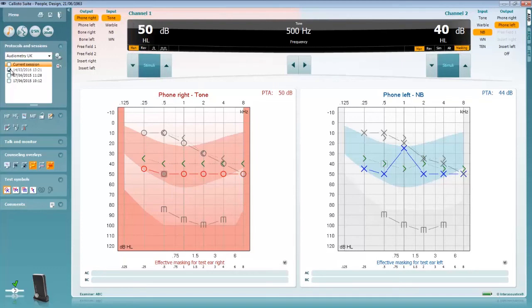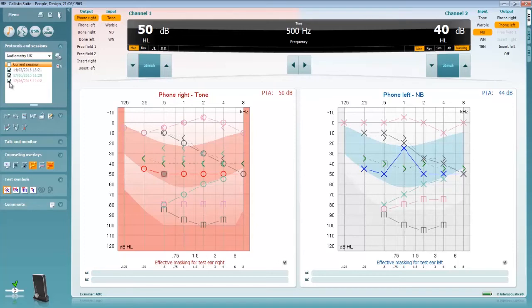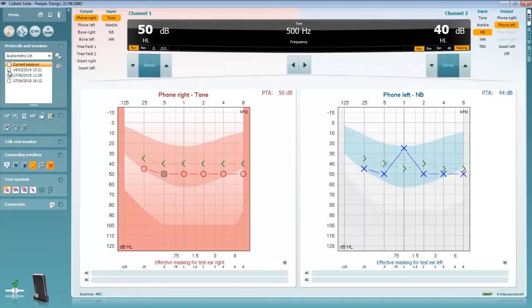Should you wish to bring an audiometric session into view for comparison then you can choose to click on the check box alongside the audiometry date. This data will then be shown on the audiogram in a lighter colour. This allows you to perform testing on top of the historic data or to show progression of a patient's hearing loss when explaining their hearing impairment.